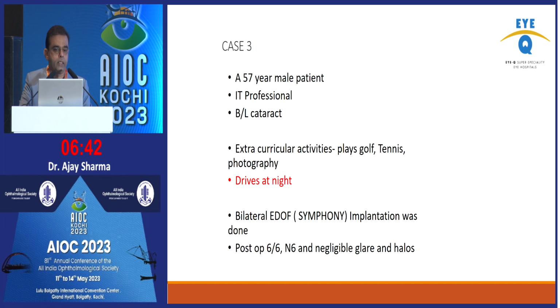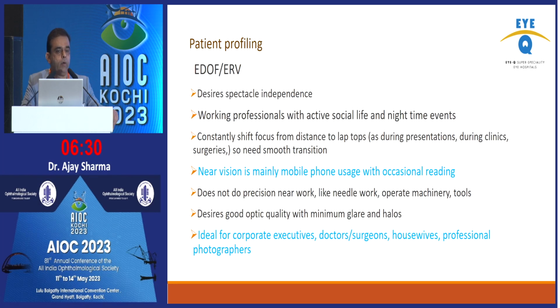This is another example of a simple EDOF where a Symphony was implanted. Here again, the patient wants to drive at night, and extracurricular activities are like golf and tennis and all. Now, why EDOF? Again, the patient has to desire spectacle independence. Mainly, we use it for working professionals with an active social life. Near vision is mainly for mobile phone users with occasional reading.